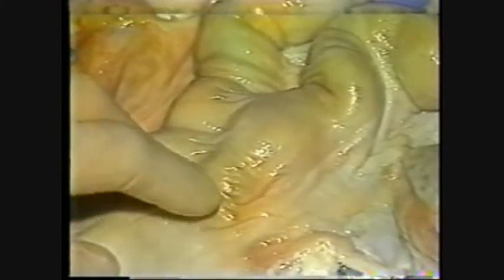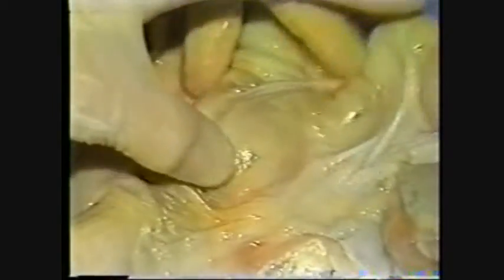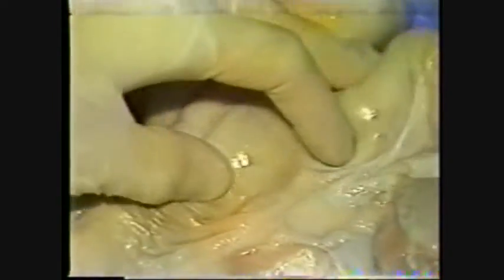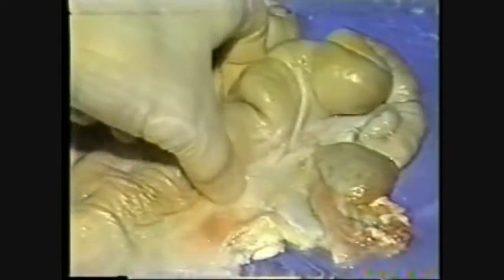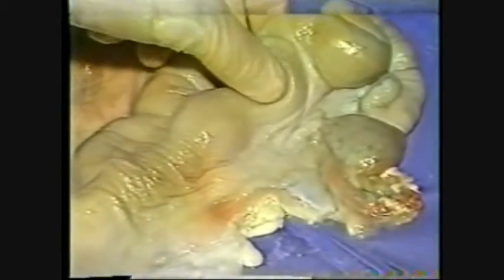Your balloon comes right up. So you'll be palpating in here, of course. You know the tip of the catheter is right here, so you know right in this area you're waiting for the balloon to come up. Comes up, that feels nice, nice and firm. When I pull back, it pulls back the tract also. It's in pretty good position, and it's more than likely going to hold and stay here.